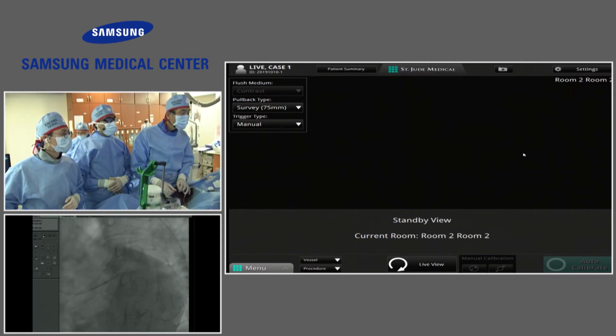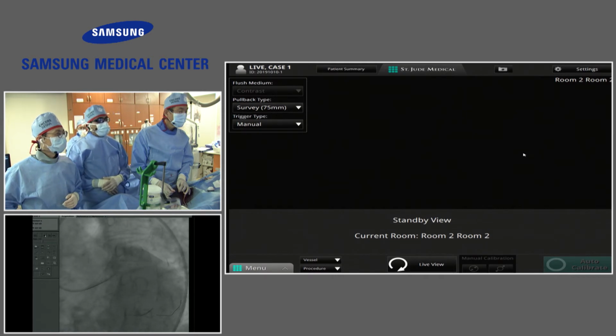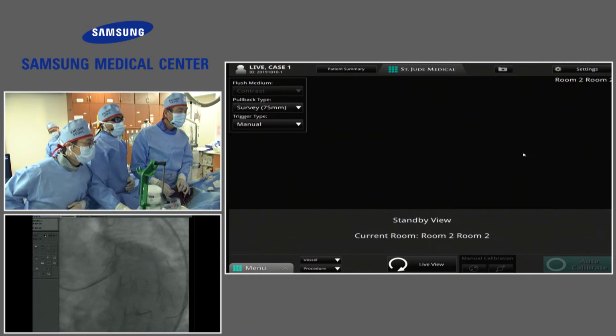I think that's false behind the lumen, behind the stent. You're right, I'm not sure. I think this is not worth the risk. We've rescued it. I think we're going to go ahead and do a culotte and not rotablate the LAD. It's outside of the stent.